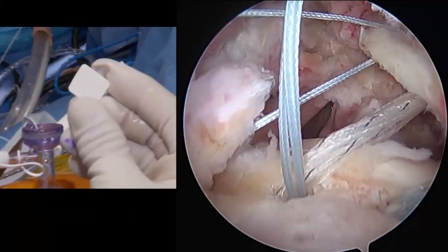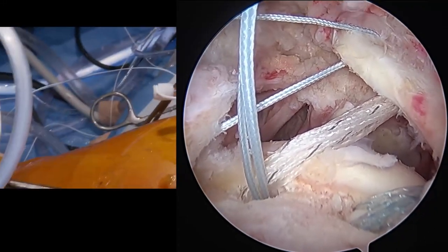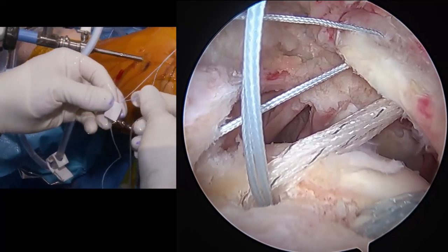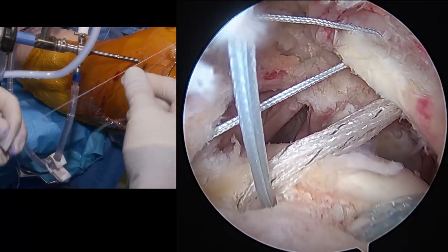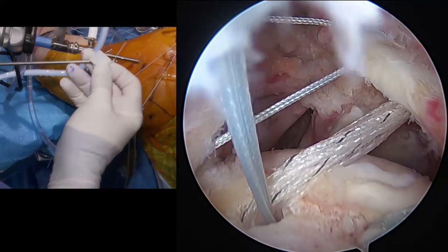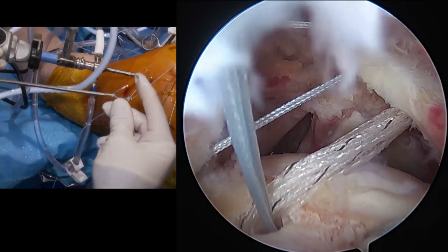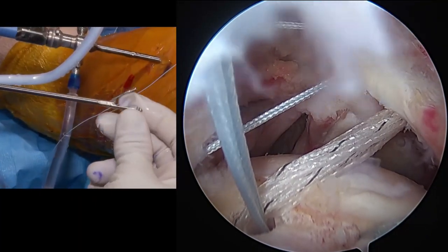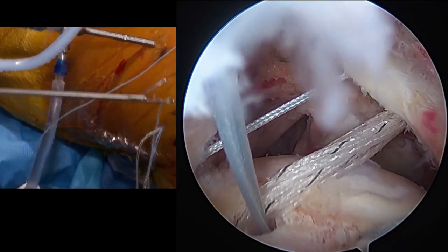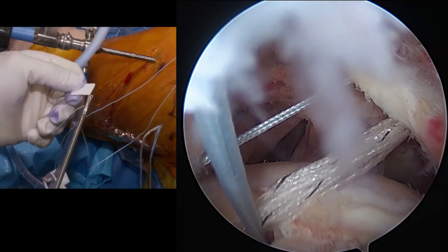And we have a sponge or a wick that can hold on to the biologically active materials that we're going to put down in between. It'll spread over the area, and it'll be a little bit too big or awkward, but we can just trim back the edges. We just want to have it in the space, because some people have used a mega clot, other people have used fibrinogen glue, but something to hold the biologically active materials in place. And actually, probably the best thing is this synthetic fiber that works very well, made out of a nanofiber. And we just have to kind of pull it down into place.